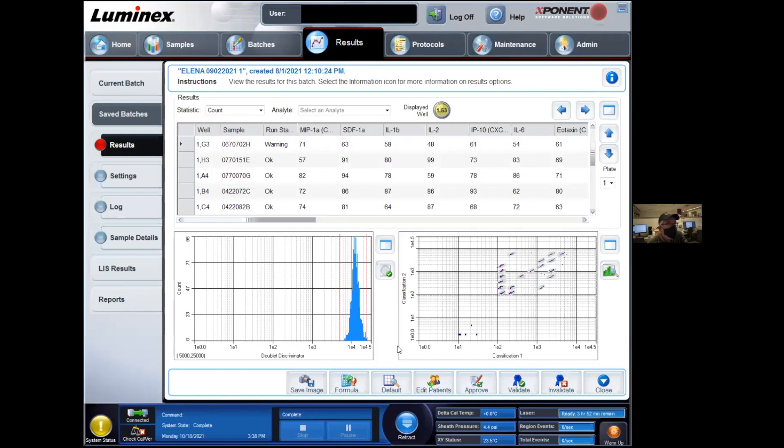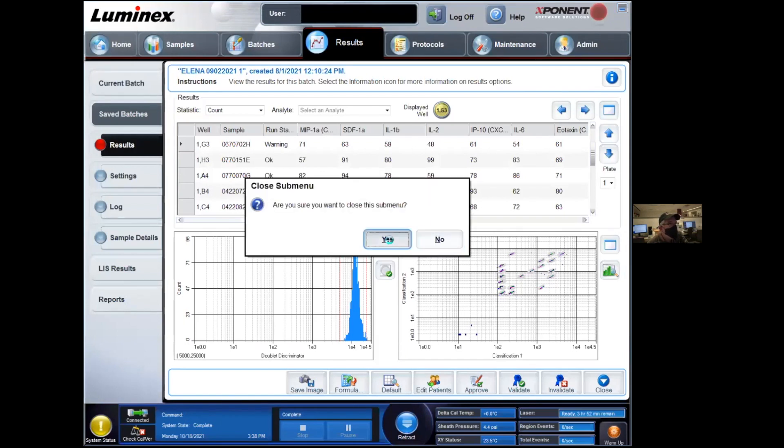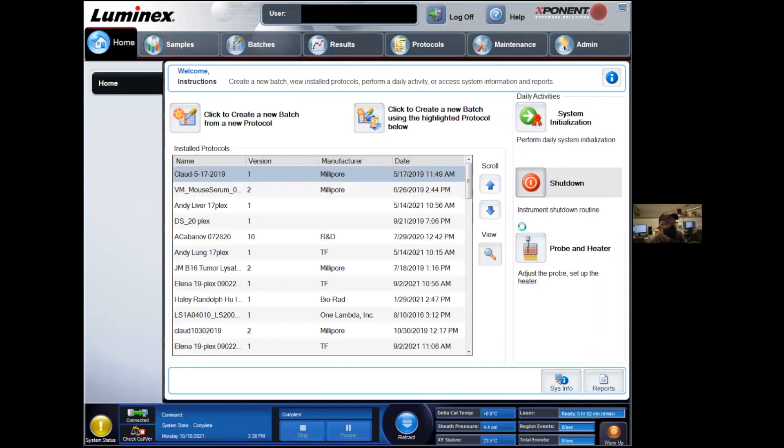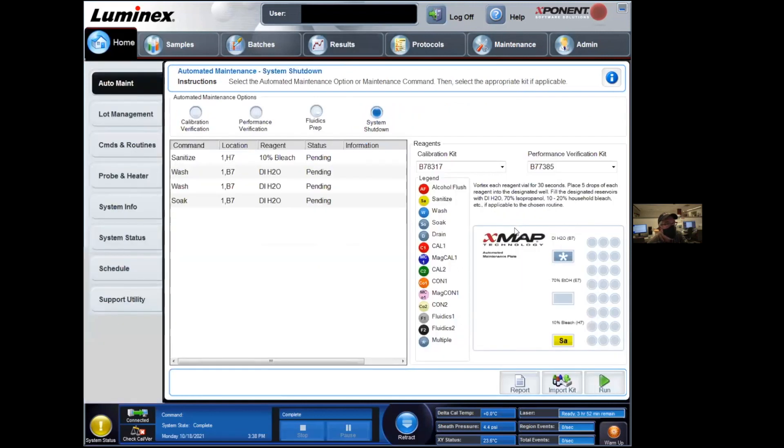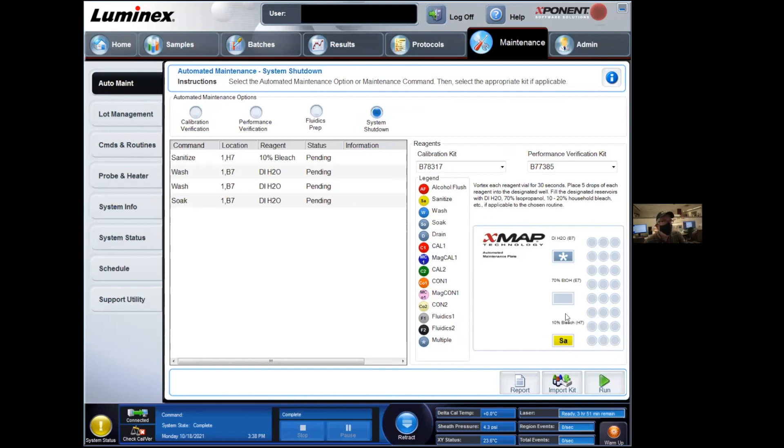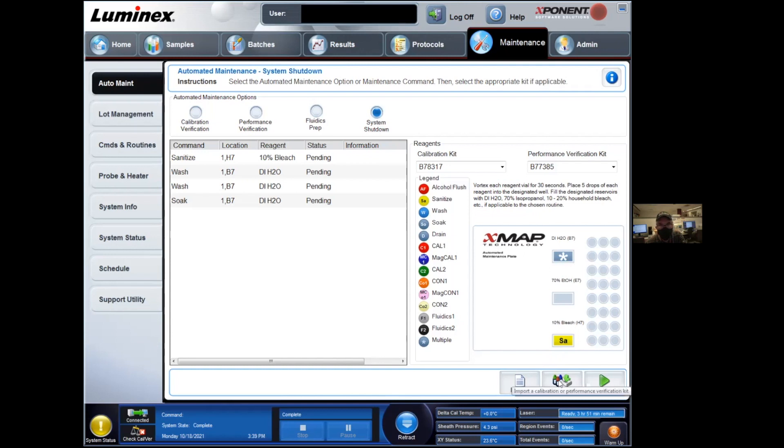Once you're done with the experiment, we ask people to clean after themselves. In this case, all you need to do is click on the shutdown button, and you're directed to the auto maintenance page. You're going to be asked to fill the XMAP technology plate with a bunch of DI water at the top and bleach at the bottom. The bottles are available next to the machine. Put that in place in the instrument and let it run for about five minutes. Once done, take the plate out. At that point, you can safely close the software, log out of Windows, and you are basically done with your Luminex experiment.